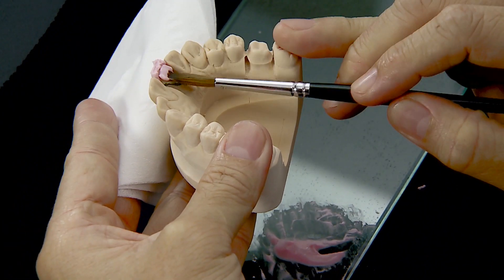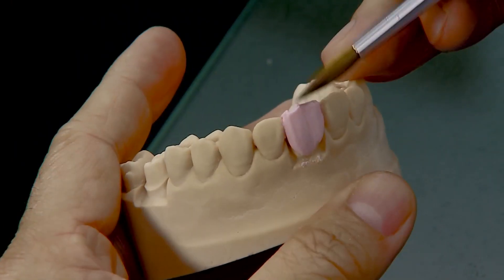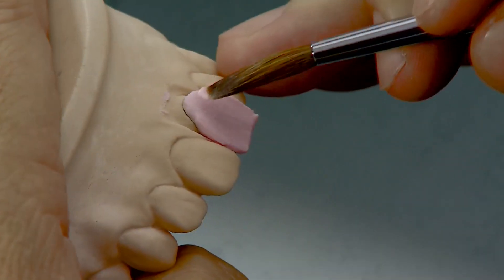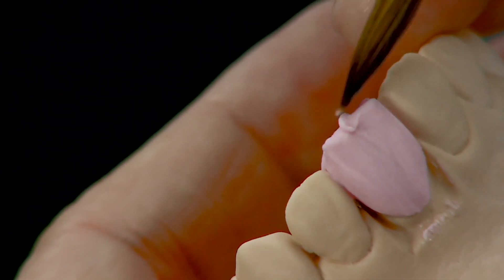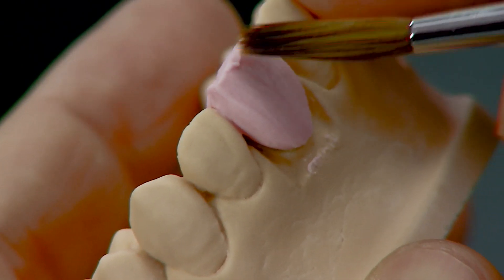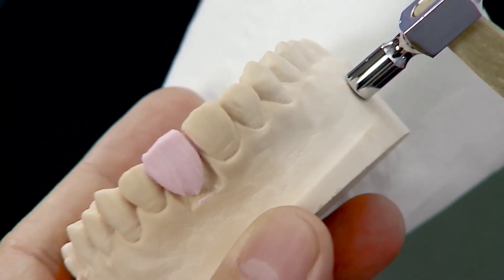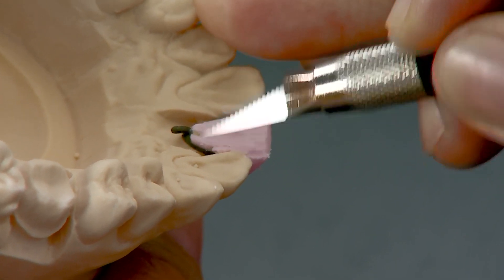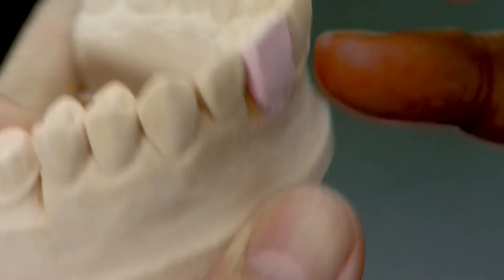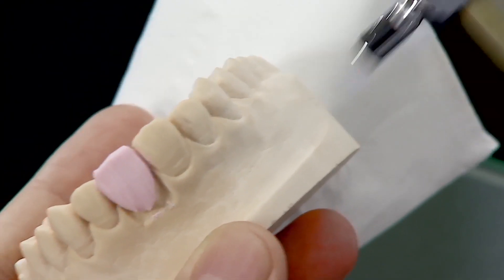Apply the body porcelain onto the palatal side and build up to its natural form. Smoothen the surface texture with a wet brush, add more porcelain to insufficient areas, and condense. Correct the tooth form with the Lecron carver and gently tap the model with a small hammer to condense the porcelain mixture and avoid crown deformation. Remove excess from the proximal, labial, and cervical areas with a porcelain knife.